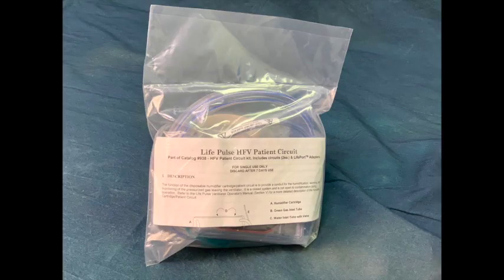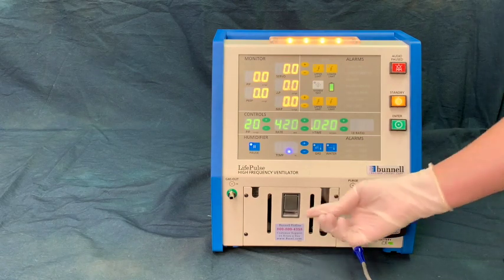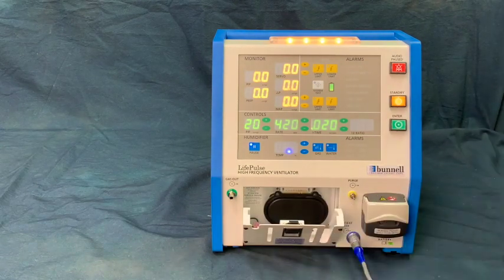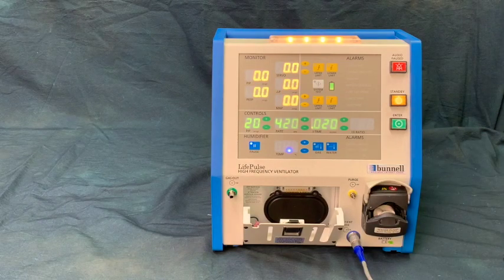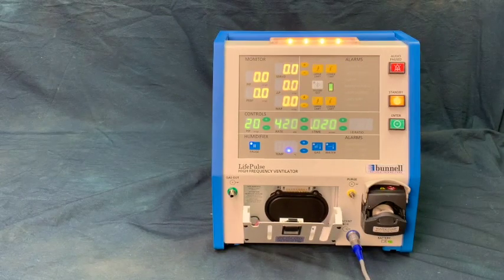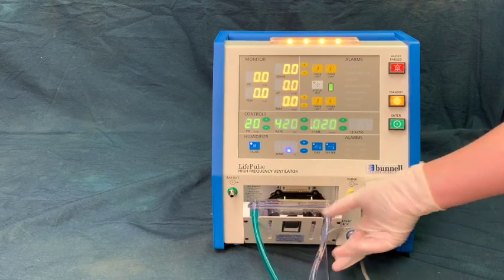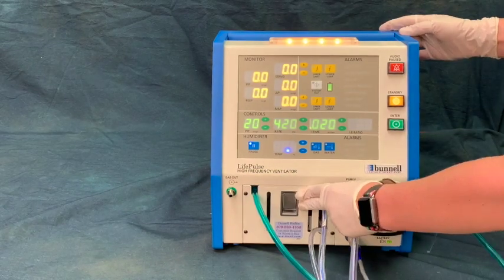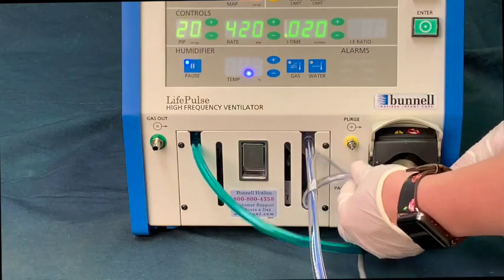A patient breathing circuit must be installed to use the Life Pulse 204. Follow these steps to install the circuit. First, open the cartridge door by lifting the latch. Open the pump door by lifting the upper portion and insert the humidifier cartridge into the receptacle. Close the door firmly until the latch locks shut.